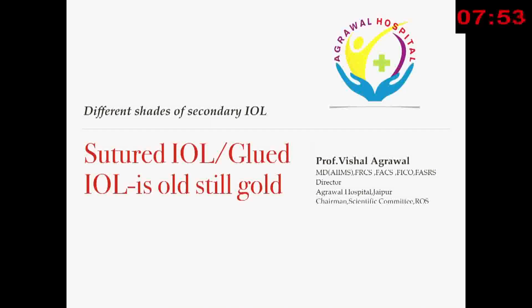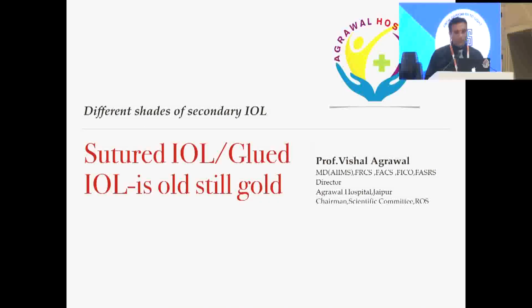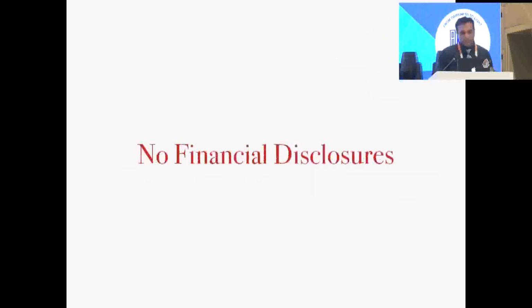Thank you, Srinivas, for having me here and making me a part of this wonderful instruction course on secondary IOLs and IOL subluxation. I'll be discussing sutured IOL and glued IOL, this old is still gold. For this presentation, I had to dig up many old videos which were very difficult to find.